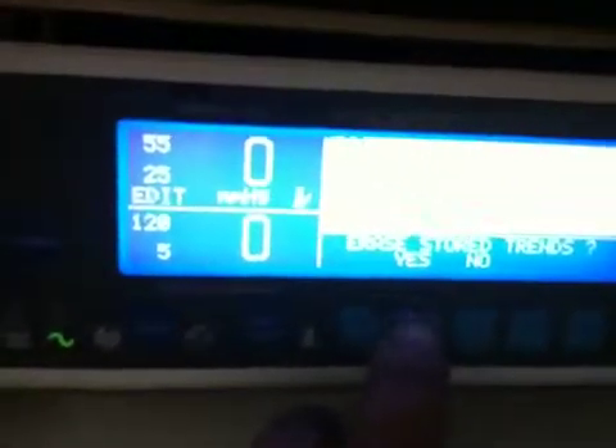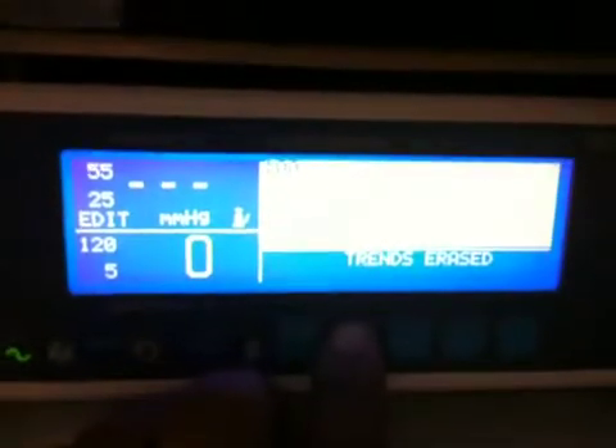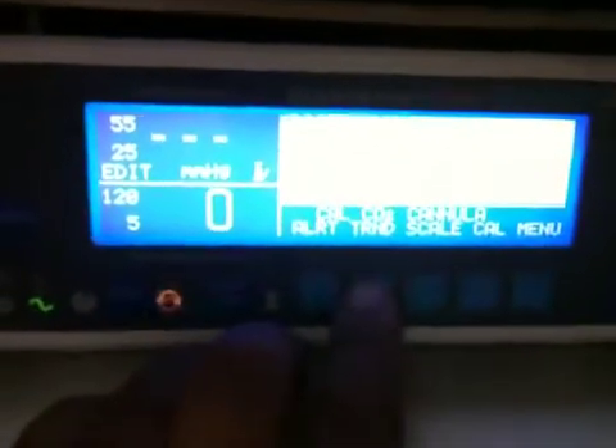Turn the audio off by pressing it for a few seconds. Then you can say Erase Trend. It's going to erase the trend.